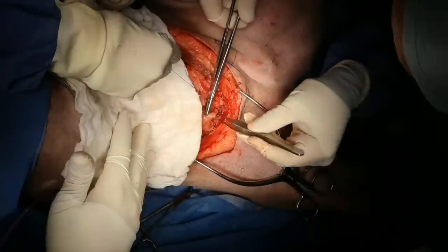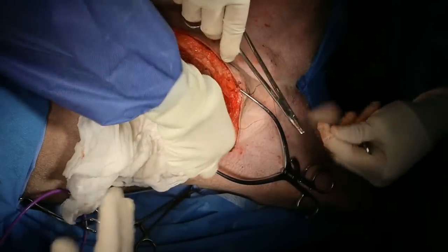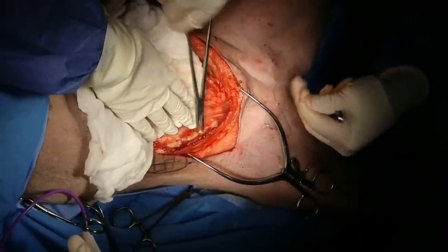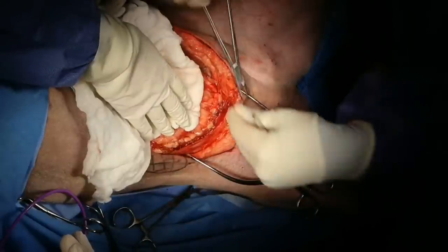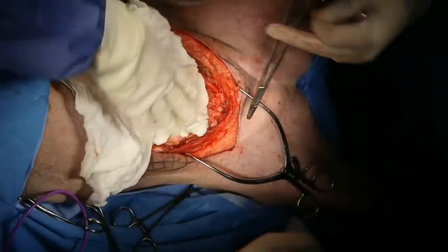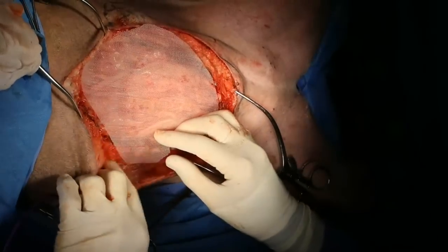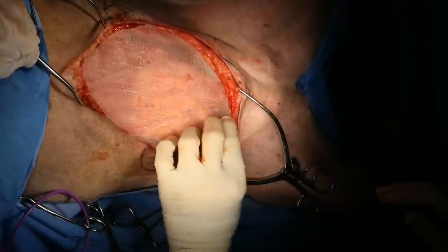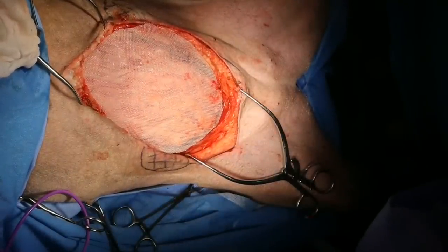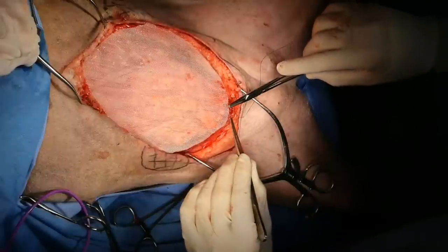There's a question about the benefits or prospect of using CO2 laser as opposed to electric cautery. I am not a big laser proponent. I have never found any benefit of it over scalpel or cautery. The theoretical benefits are less pain, more rapid healing, that kind of thing. But in the cases where I've used it, we have had re-bleeding, where I thought it was cauterized during the surgery and then it started bleeding again afterwards. So I tend not to use it. As you guys are aware, I love toys, and if I could find an excuse to use a laser, I would definitely buy one, but I have not found a benefit to it.